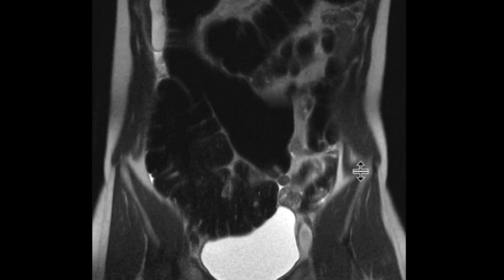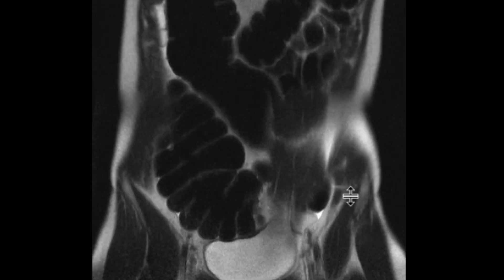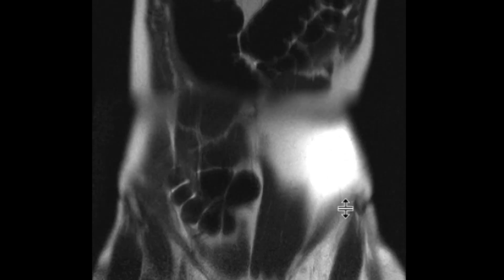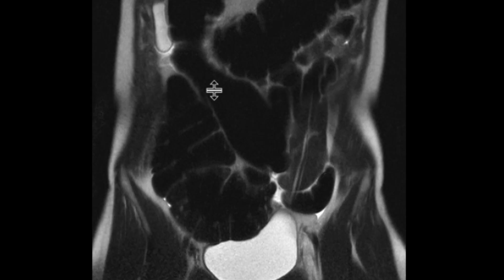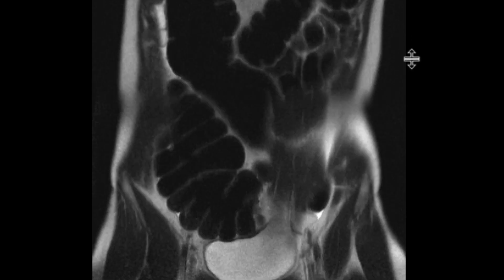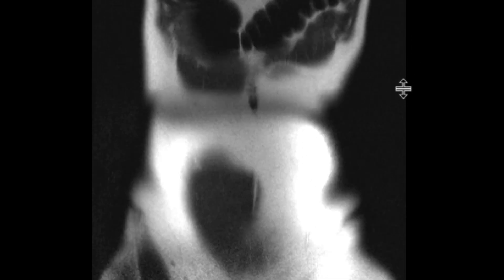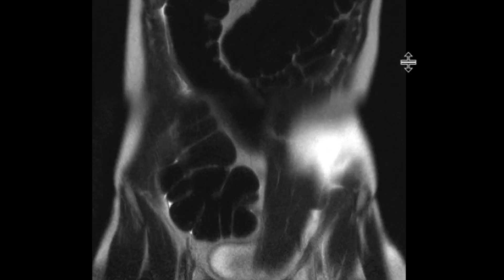What we can notice is that on these coronal T2-weighted images, the large bowel is quite distended. You can see these loops here of sigmoid colon and transverse colon — all of it is really distended.